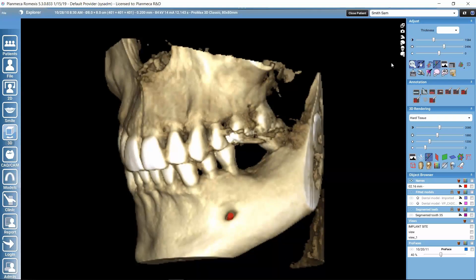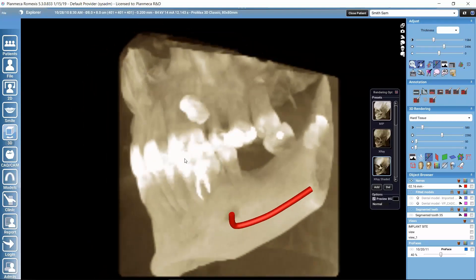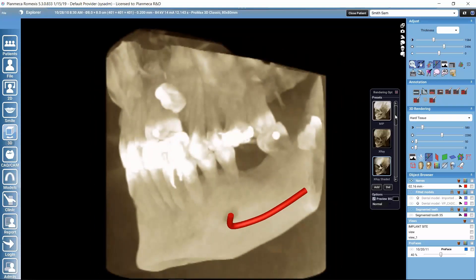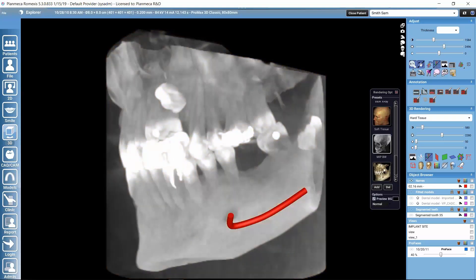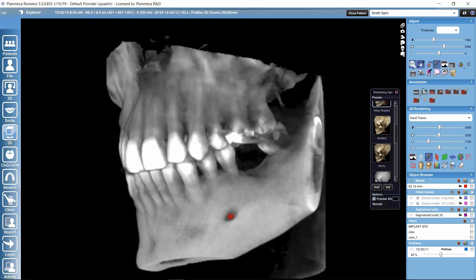Let's look at rendering modes. The wrench-like icon for viewport settings provides a list of rendering options — different rendering modes help visualize different anatomical structures. Toggle between them by clicking on the list. The currently highlighted option with a border is the default rendering mode, which is applied when the module opens. To change the default, right-click on the desired rendering mode and select 'Set as default preset'.